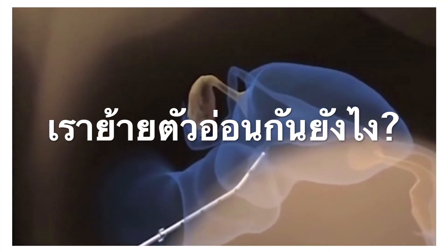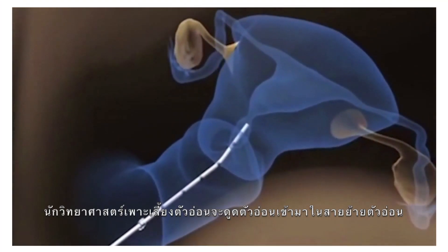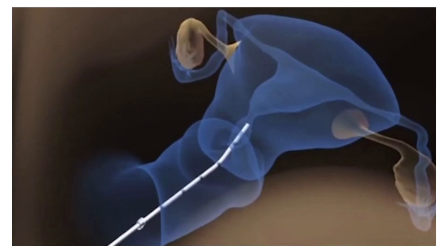Once everything is ready, the embryologist will load the embryo or embryos into the catheter and then hand the catheter to the physician.